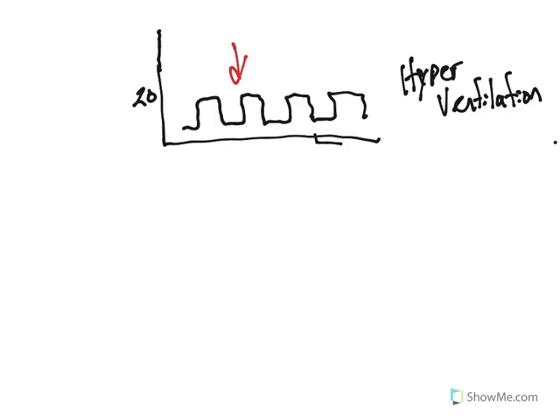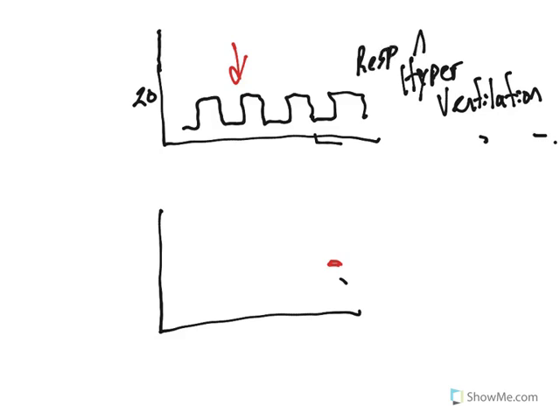That would be ridiculous. Anyway, so if we're talking about a patient who has a metabolic issue, a lot of times what we see is sort of a flipped look. So if we're talking about a patient who is in metabolic acidosis, right? They're in metabolic acidosis. This up here is respiratory alkalosis.